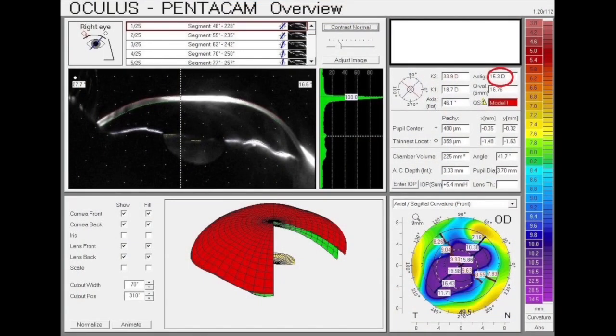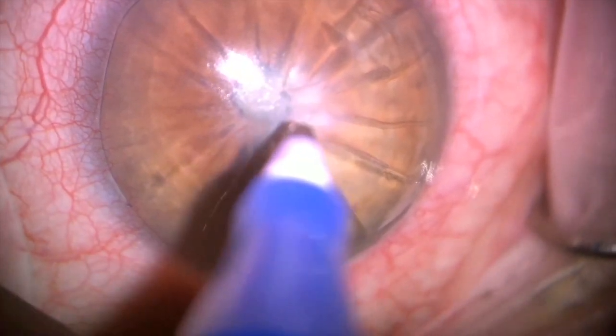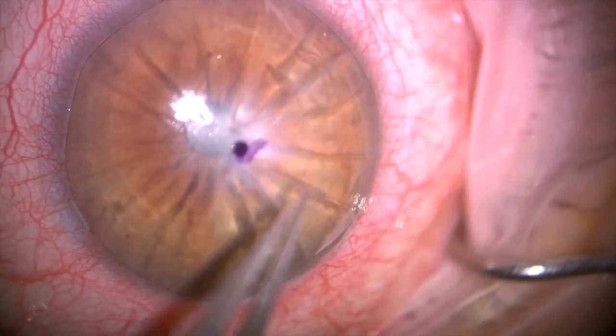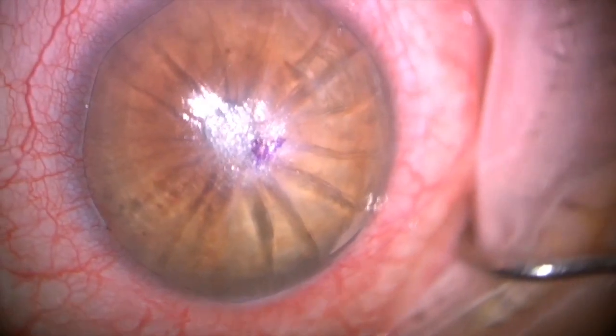This is a patient who's a surgeon with a dense central blinding scar, criss-crossing and deep open RK cuts, and high irregular astigmatism of over 15 diopters. I planned an anterior lamellar keratoplasty here, judging the RK incisions that are open and very fragile, with a cornea less than 300 microns.